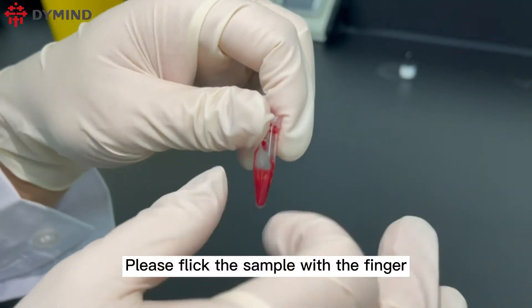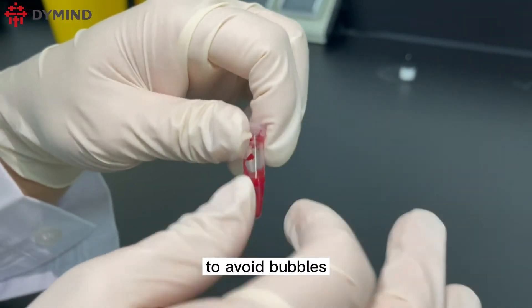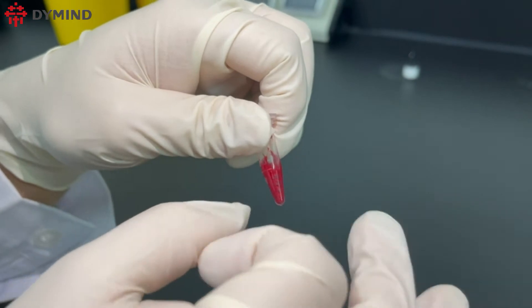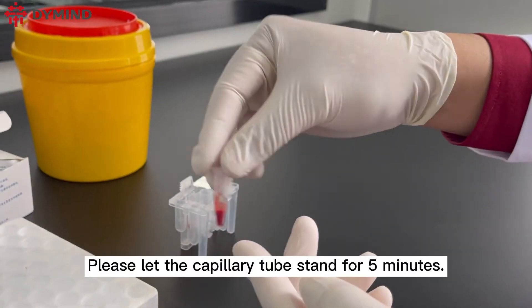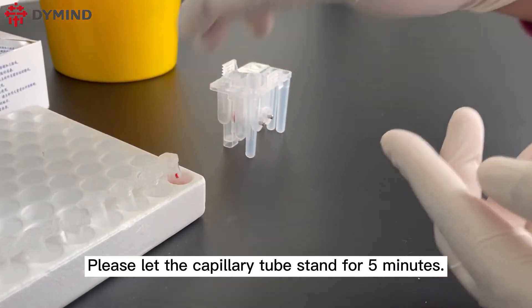Please flip the sample with the finger to avoid bubbles. Then let the capillary tube stand for five minutes.